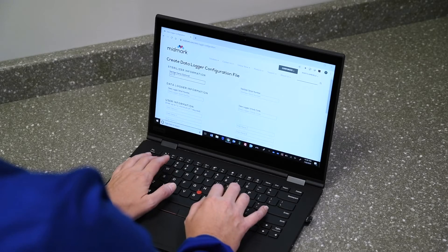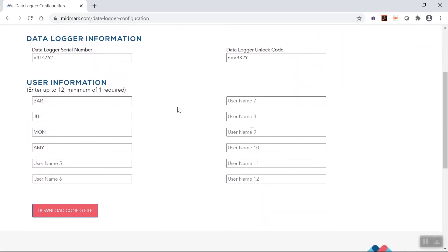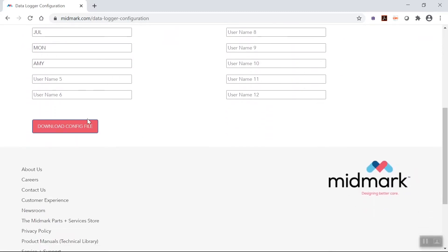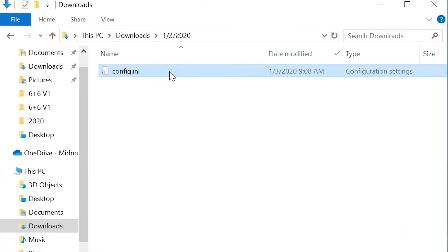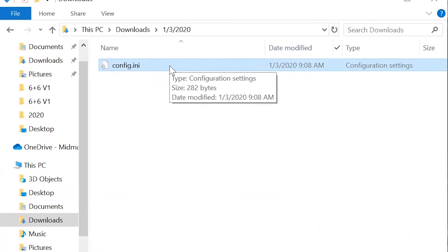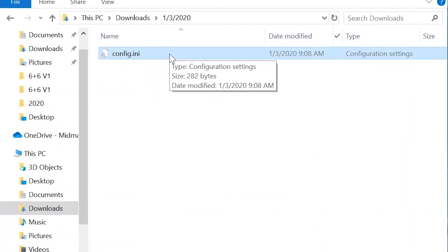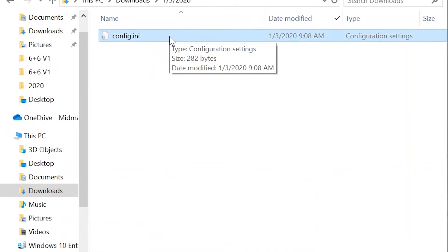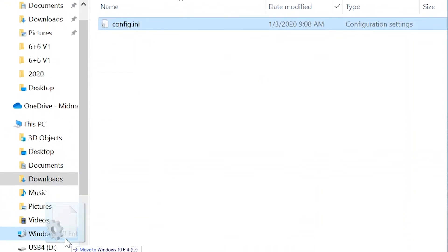Complete the form on the page. Once the form is completed, a file named config.ini will be downloaded onto the computer. Locate the file in the computer's downloads folder and save this file to the sterilizer data logger's USB device installed on the computer.